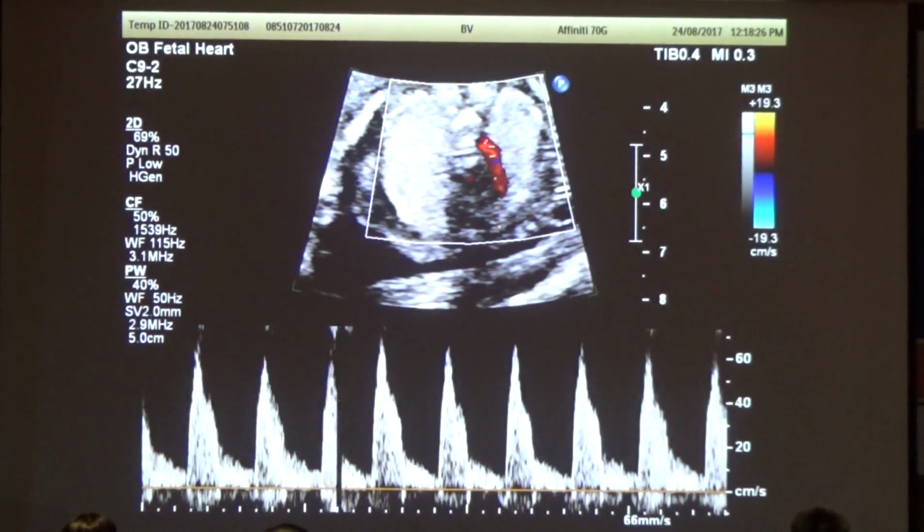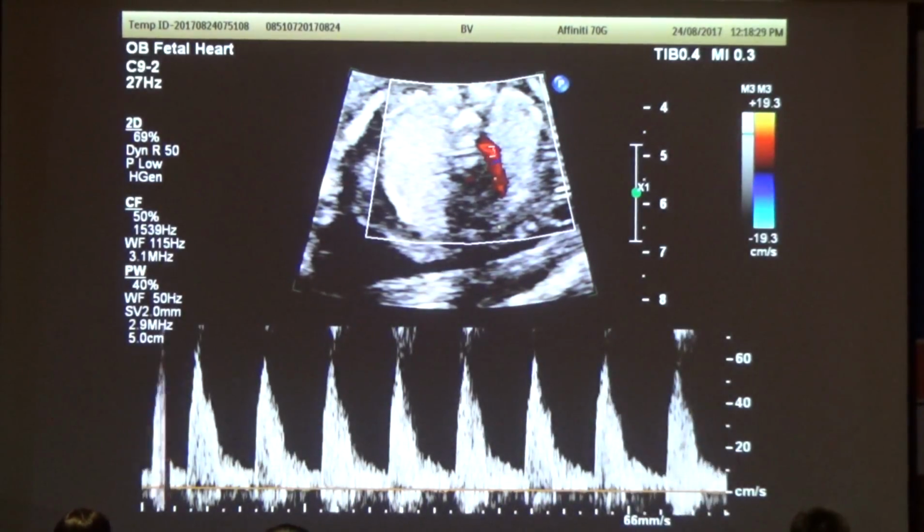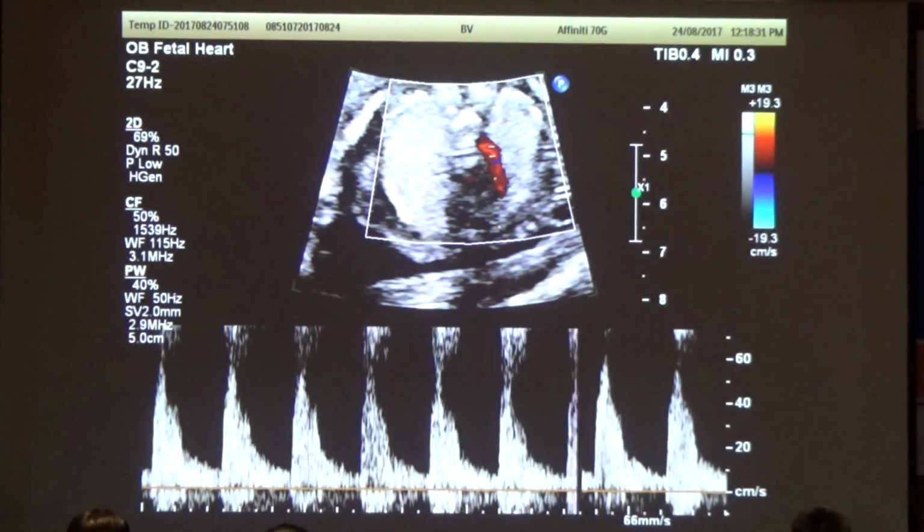You know any other sphincters in the body besides that? The esophageal, you actually thought I was going to say something else, didn't you?